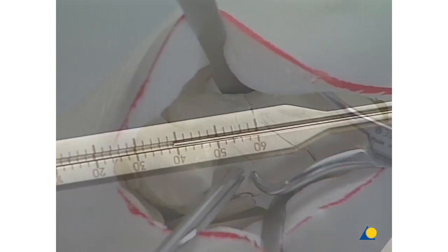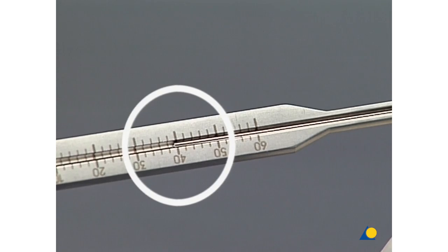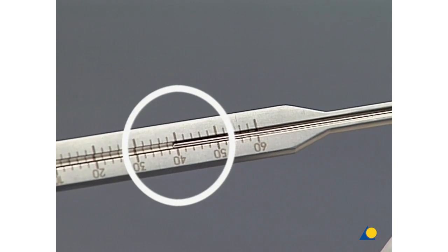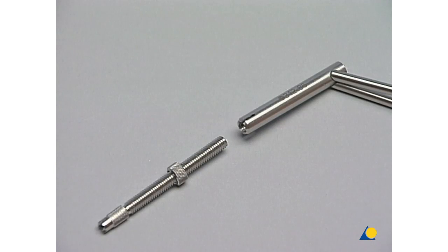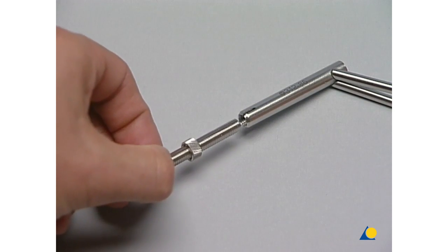We determine the screw length by measuring the protruding part of the guide wire with the direct measuring device. The drill guide insert is screwed into the holder.